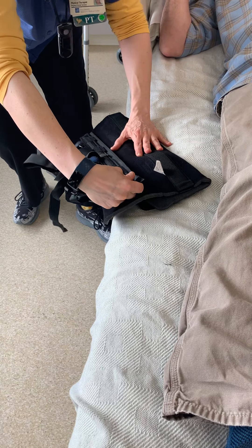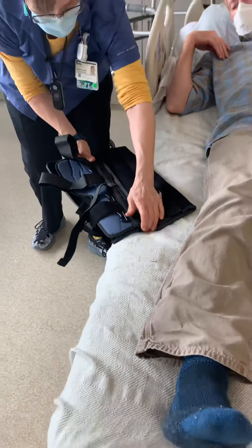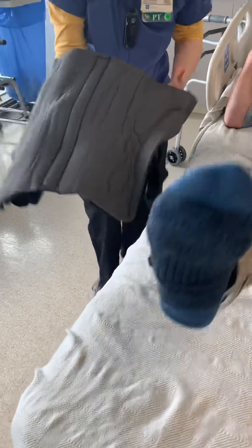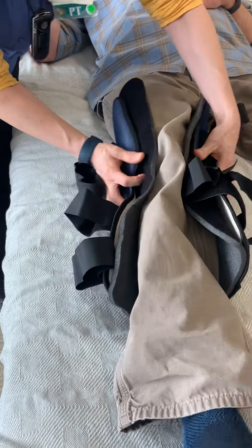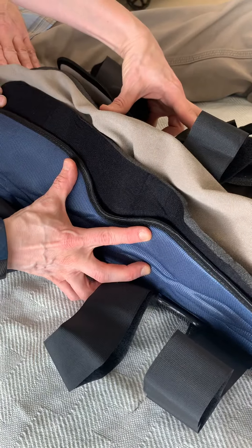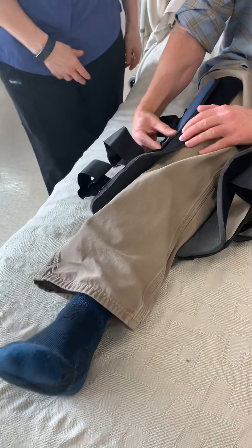Especially if you've got somebody with a bigger leg — maybe a larger thigh — it doesn't quite fit right. Or if the ends are driving them crazy, like we've all had patients that have been scratched by the velcro. When you close this up, you always want to look at the part in the middle that's kind of cut out — that should be roughly around where the knee is. Oftentimes what you'll see is it wants to shift down a little bit. See that cutout part?